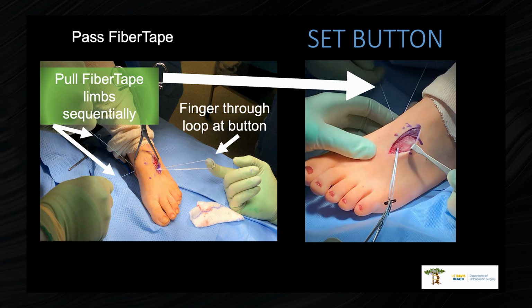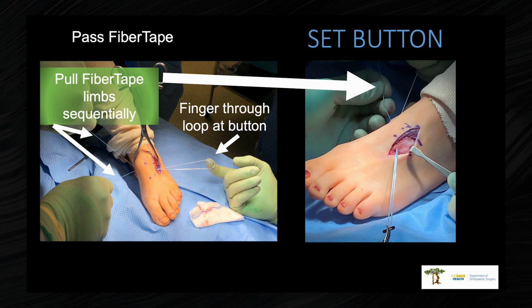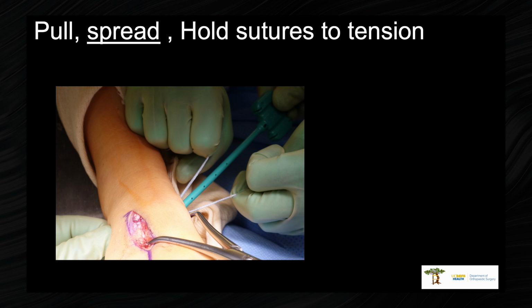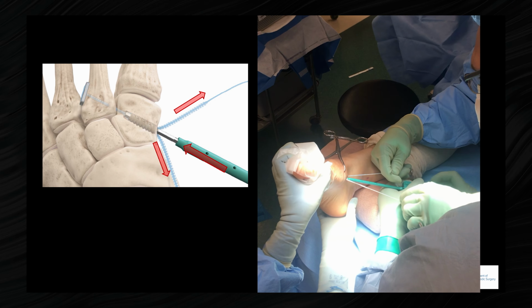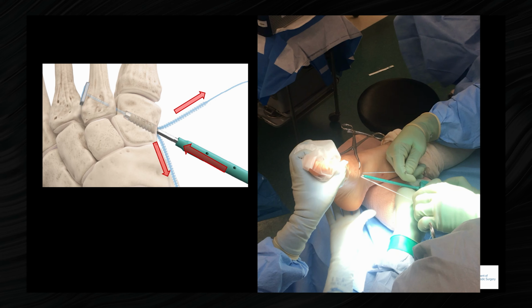You make sure the buttons are on the dorsolateral aspect of the second metatarsal, and then you put the interference screw here. You got to make sure somebody is pulling, with maximal force.